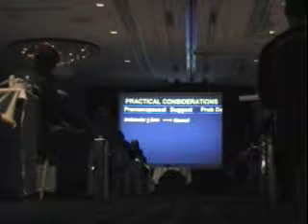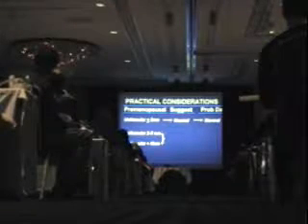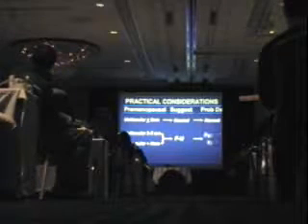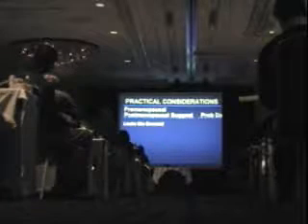And finally, if I have a premenopausal woman and a unilocular, fairly small cyst, I'm going to say it's normal. If it's between 2 and 5 or it looks hemorrhagic, I'm going to get a follow-up. Those are functional when they're over 2.5 centimeters. You might want to give her birth control pills to reset her clock and follow her up at the beginning of the cycle, a couple of cycles later.